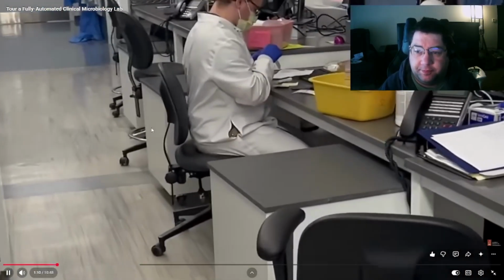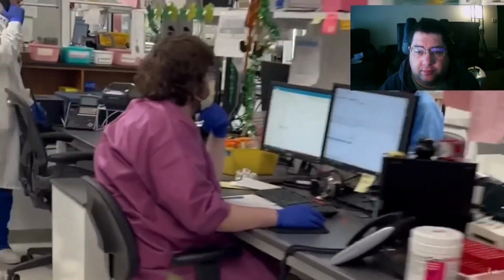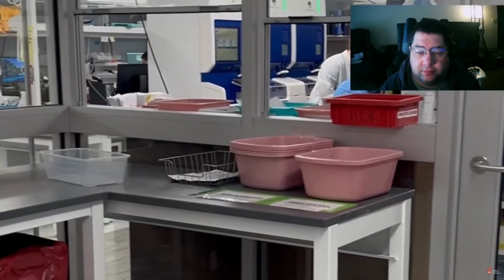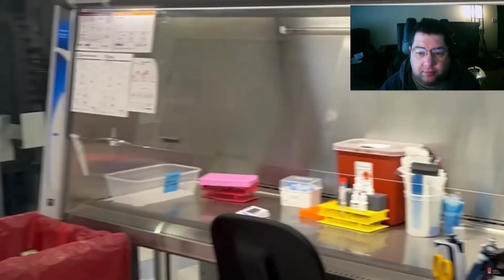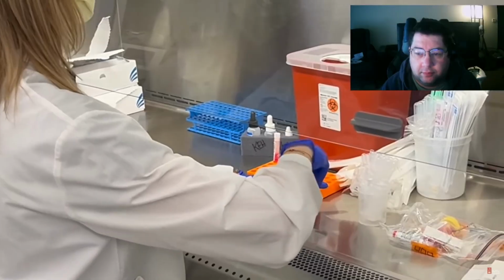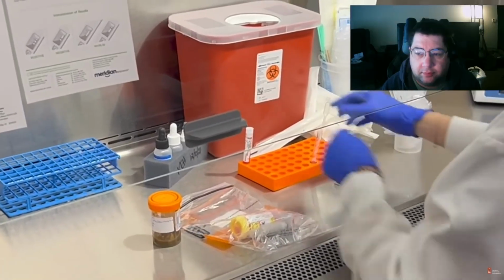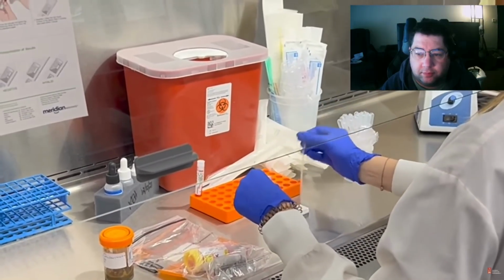Specimens are logged into our laboratory information system and are sorted by sample type for the respective lab benches to perform diagnostic testing. This is the specimen setup and stat test area. A stat test is a test with a quick turnaround time, generally less than 1 hour, as results are needed urgently for patient care. In this area, some of the tests we perform include rapid antigen detection assays for malaria, Legionella, and Streptococcus pneumoniae. Here we observe a technologist performing a lateral flow assay to detect Clostridioides difficile in a patient's stool.